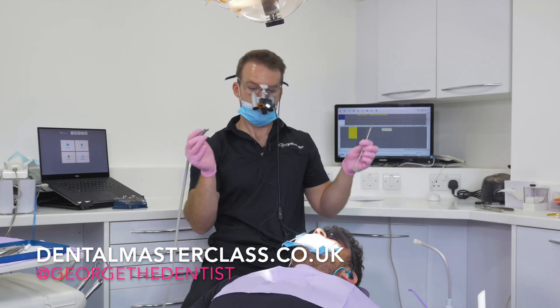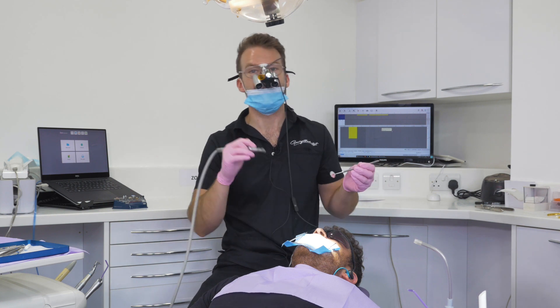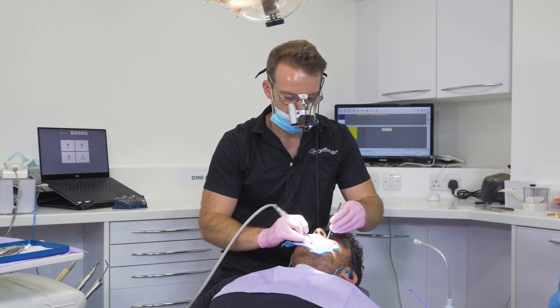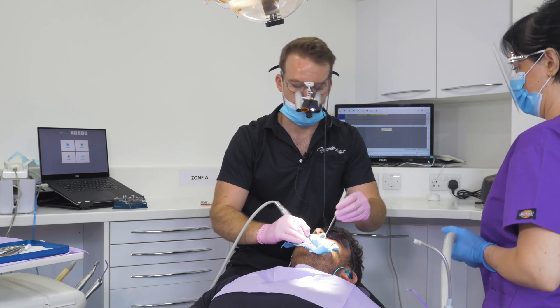The risk if you're not going to be doing this type of protection of the interproximal areas is the iatrogenic damage — you can damage the neighboring tooth and basically drill it. So once that's through, I then tickle my bur just over there over the area to do the interproximal reduction.